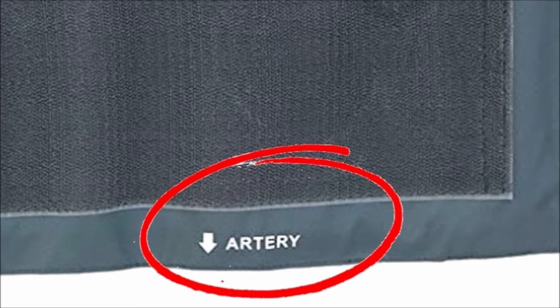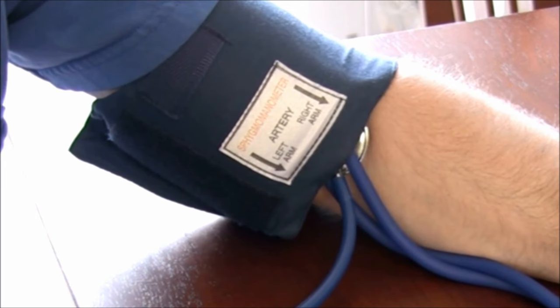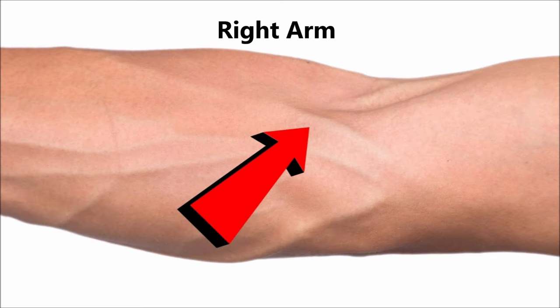This style cuff will have the word 'artery' next to the arrow. With the cuff secured correctly, the arrow or arrows should be pointing down towards your elbow and should line up with the brachial artery in your elbow crease.